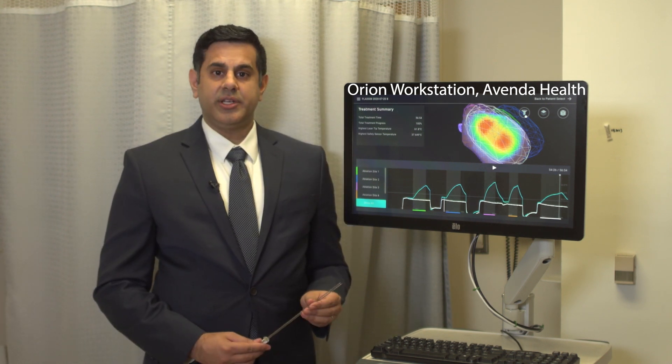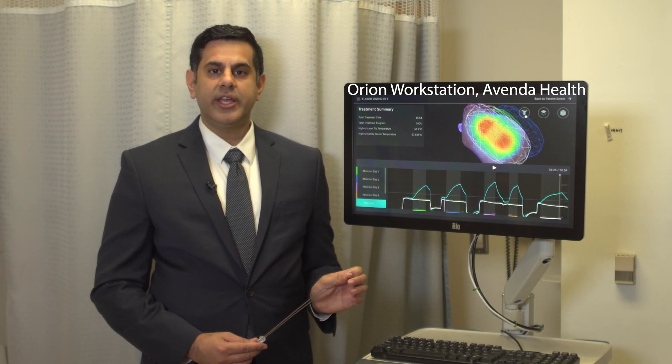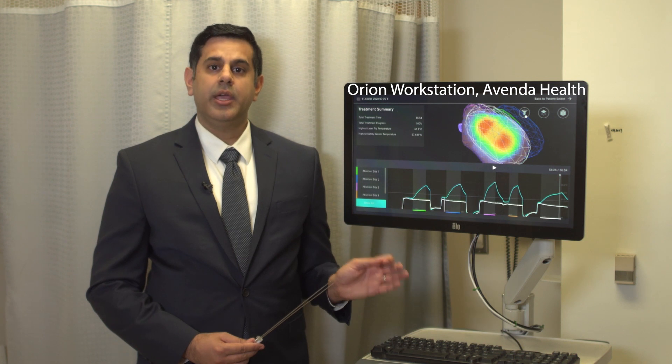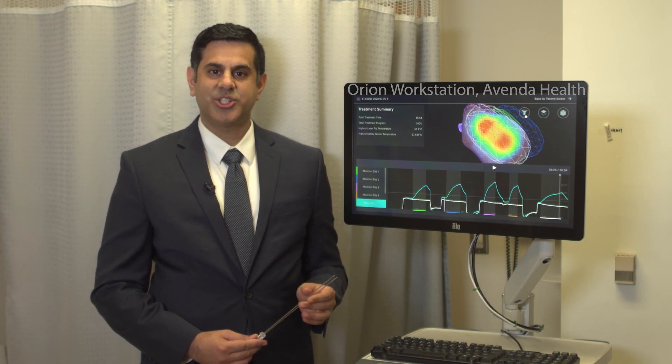During treatment, a three-dimensional heat map and expected tissue damage is overlaid onto a patient-specific prostate model in order to evaluate treatment progress in relation to critical structures.